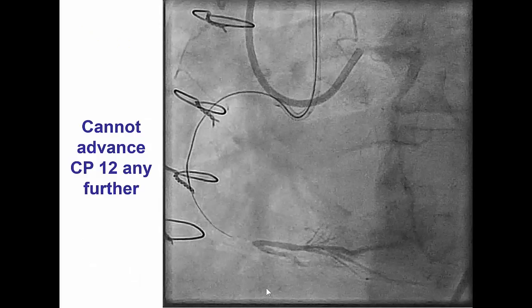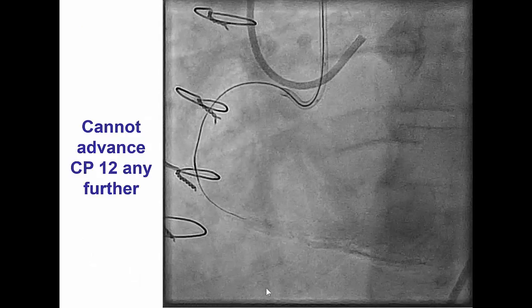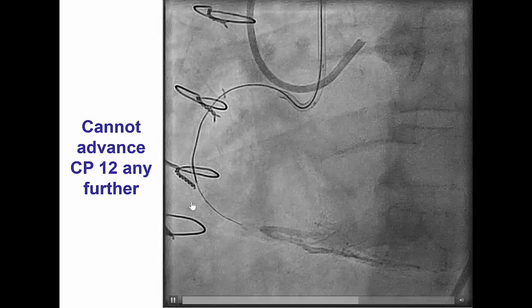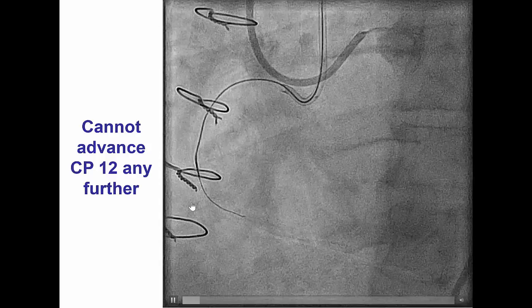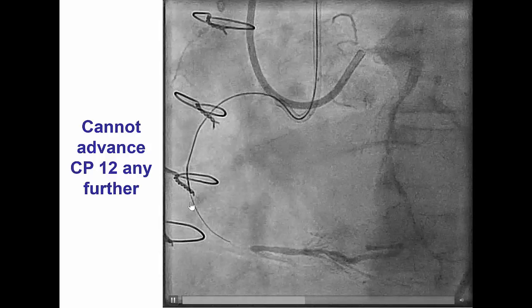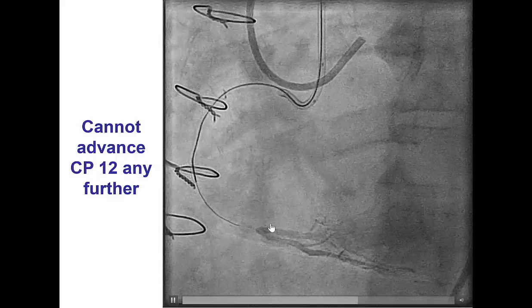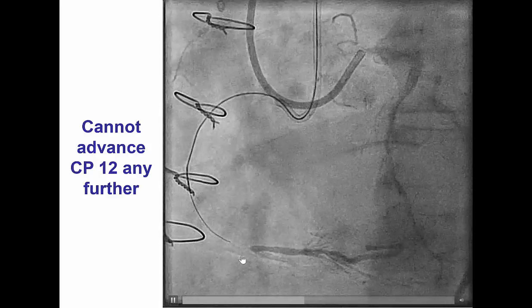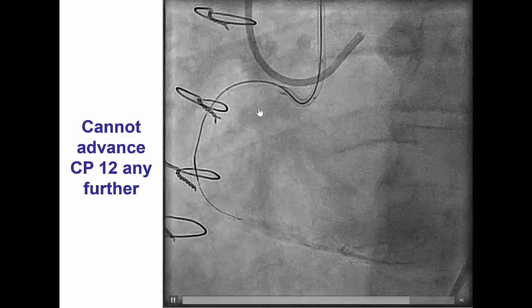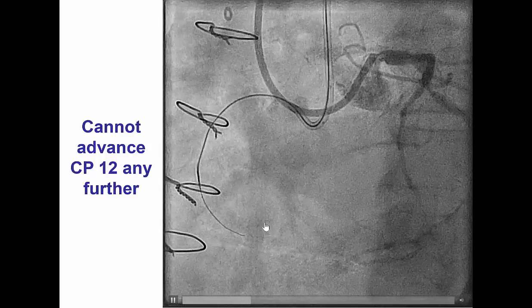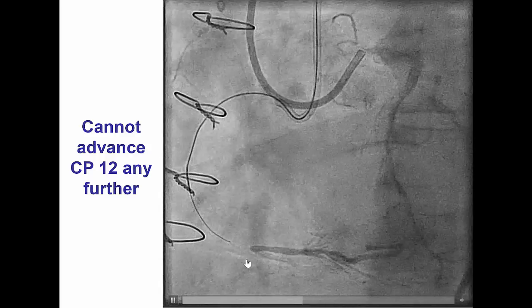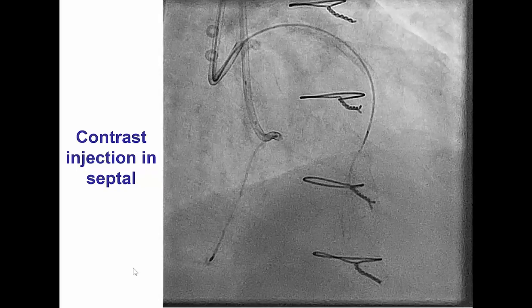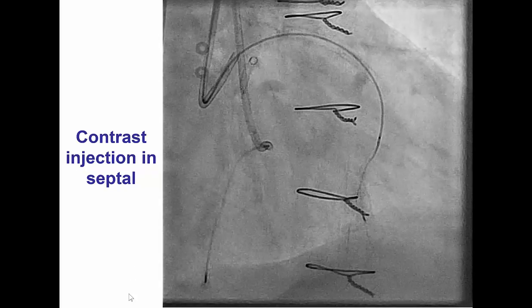We did several attempts at crossing antegrade. We used a Corsair microcatheter and several guide wires, including Pilot 200 and Confianza Pro 12. However, despite using those wires, we could only advance so far close to the distal cap. The lesion was extremely calcified and although we traversed the large part of the occlusion, the very distal part was extremely calcified and hard to penetrate. That is why we attempted retrograde crossing.